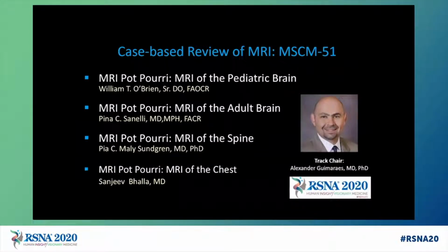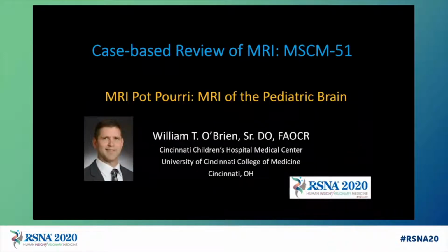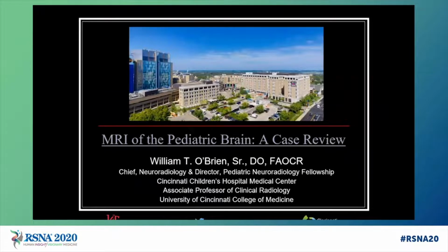We have a great lineup of cases covering the pediatric brain, adult brain, spine, and chest. I'll be leading us off with a case-based review of the pediatric brain.